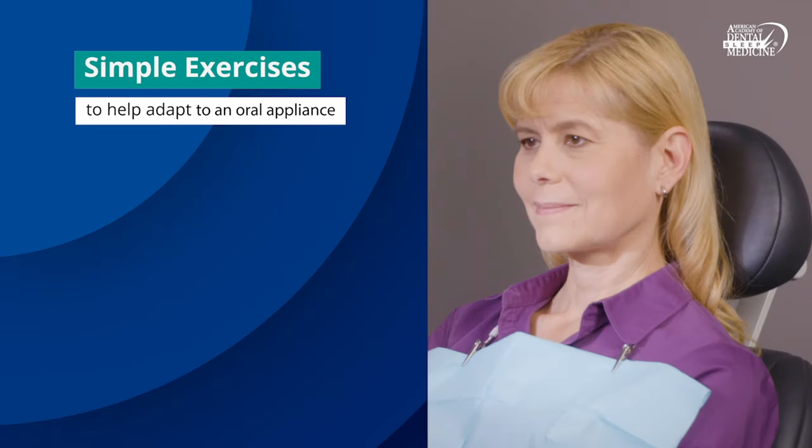Here are some simple exercises to help with jaw soreness or bite changes you experience with the use of your oral appliance.